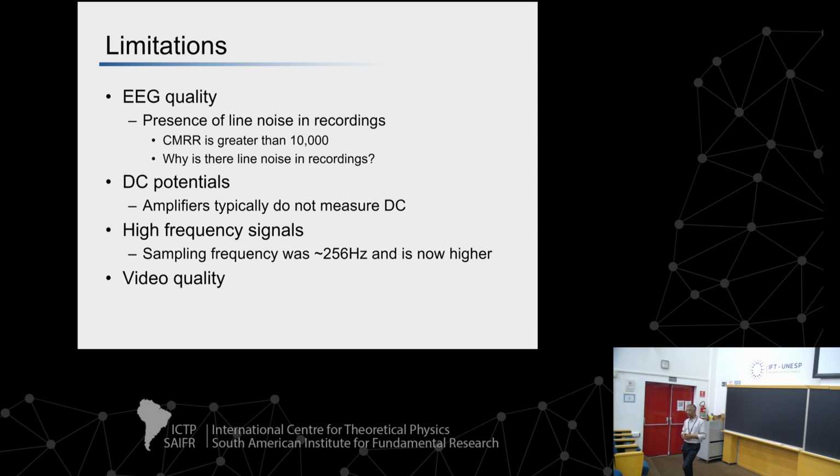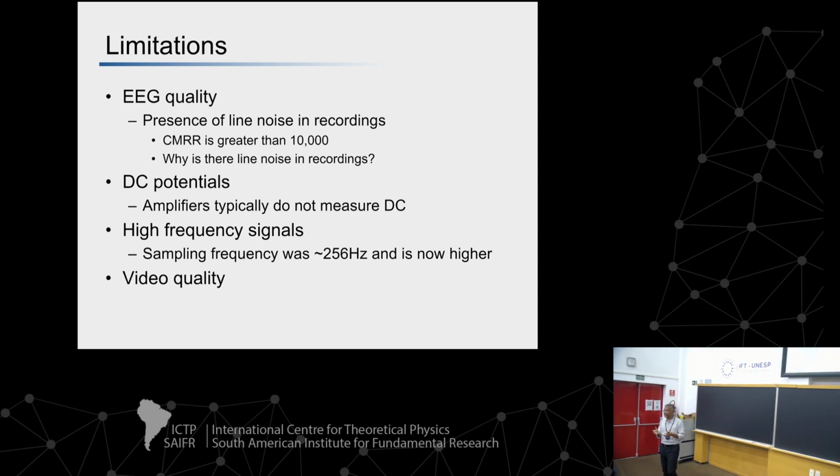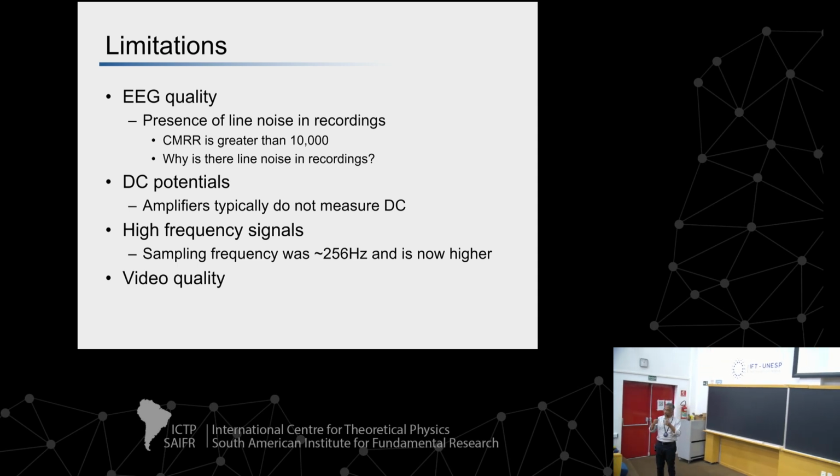Those signals are typically up to 250 hertz, or there have been some signals described up to 500 or 600 hertz or so. And the rule of thumb is that we go 5 times higher than the highest frequency. So if it's about 500 hertz, you want to be at least at 2.5 kilohertz. In my clinic, they go to 4 kilohertz. But again, that's more on the research side, and we're still fully understanding how best to capture HFOs, high-frequency oscillations, and how best to understand their relationship to the seizure onset area and surgical outcome.